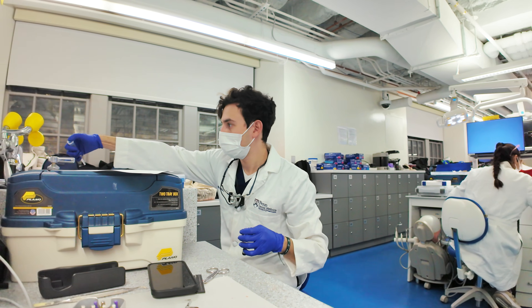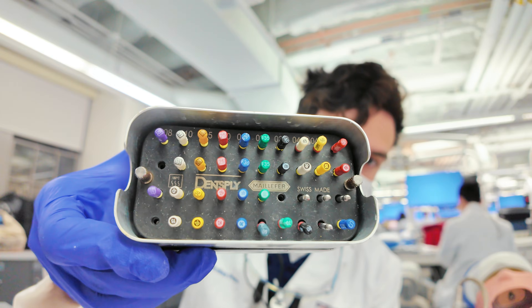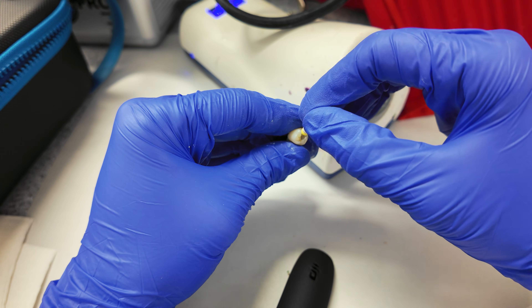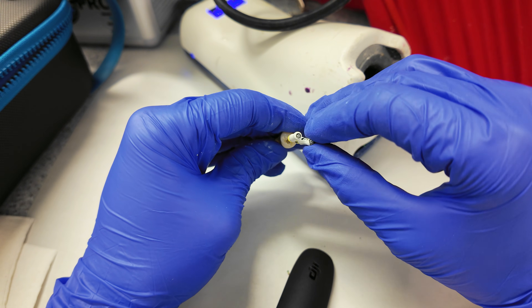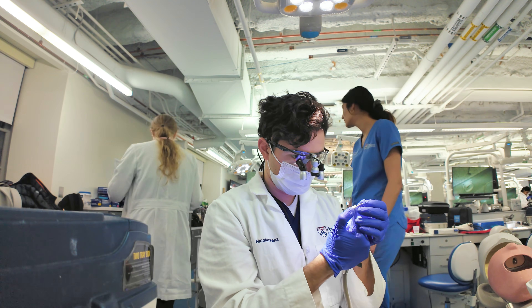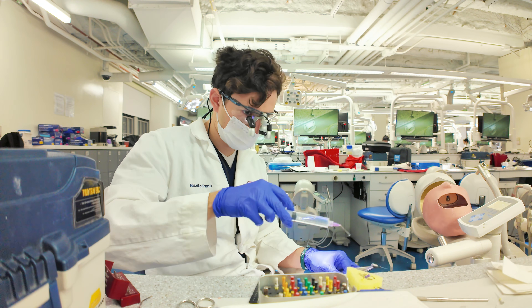We recently started Endolab this semester. In this lab, I prepped and obturated the buccal and lingual canals of a premolar. I started by measuring the working length of the canals with a size 10K file. From there, I placed a size 15H and 15K file in the buccal and lingual canals respectively, which allowed me to visualize and prevent confusing the canal locations as both files look different on an x-ray. After confirming my working length, I negotiated my canals by starting my file sequence to remove the infected pulp and clean and disinfect the canals.